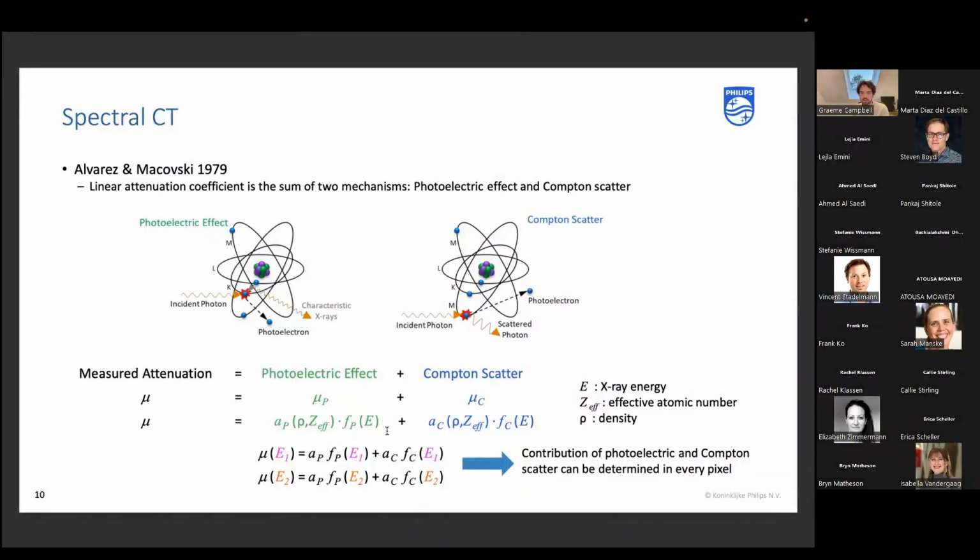Whereas a cyst or something like that would have a higher density, but still a low atomic number. And the Hounsfield unit might be similar, but the atomic number is different, or the density. So this is where, if we add up the attenuations of each type and we scan at two different energies, or we have two different spectra, then we can solve for that. Mathematically, theoretically, you could, if you know the profile of the beam, calculate this. And that's the essence of dual energy or spectral CT to determine the materials.